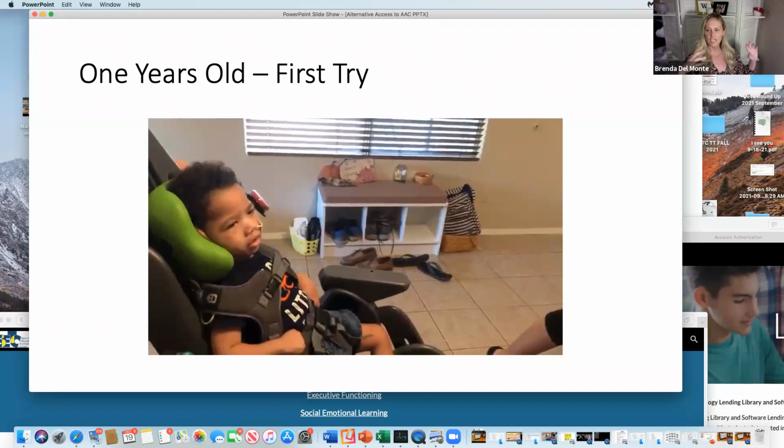And so as your team gets going, you make up these little rules. It doesn't matter. There's nothing magical about those colors. They twist off and you can put whatever you want, but it allows you to have some consistency within your team. And what he's doing is clicking and listening. Depending on the page, you might be on toys one day, songs the next. I say, is that the one or something different? Is that the one is my select switch. Something different is my scan switch. And that way that vocabulary works on whatever page you're on.